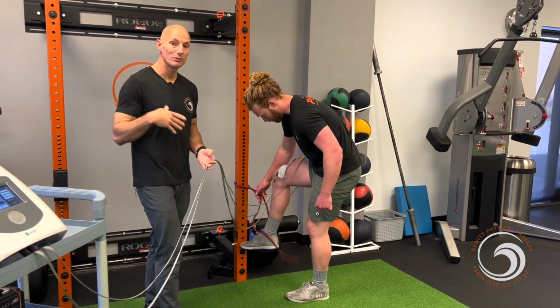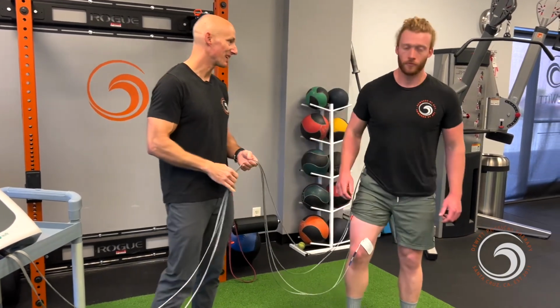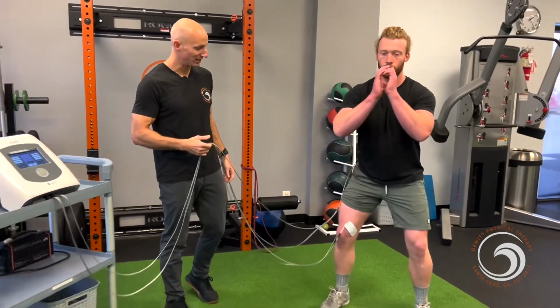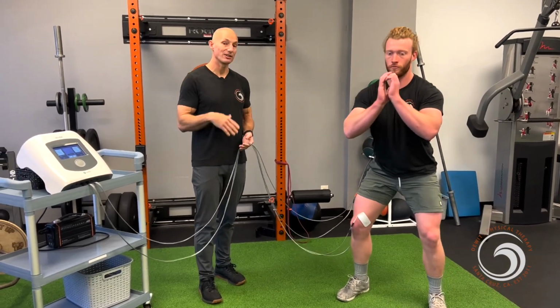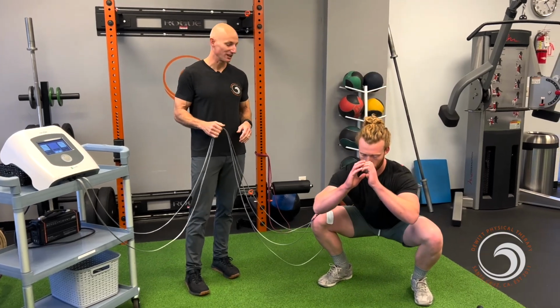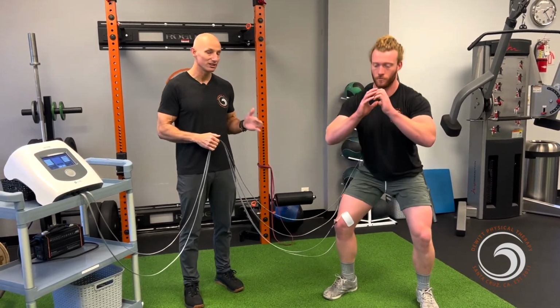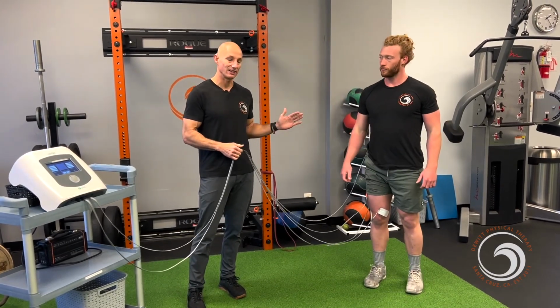Now, as we move into more of his pattern building, we can work on something as basic as an air squat, right? So go ahead, nice and slow for me. We're going to work him through as much range as is indicated. In his case, it's just for demonstration, so I'm going to have him do a full range air squat. But we're going to get good, solid muscle contraction all the way through because that stim is staying on constantly.